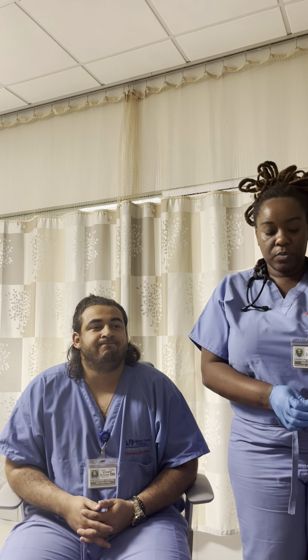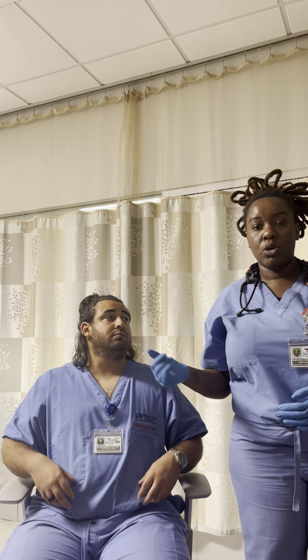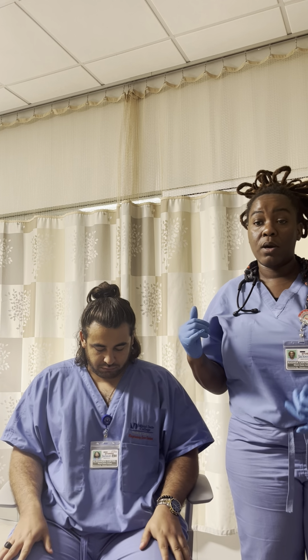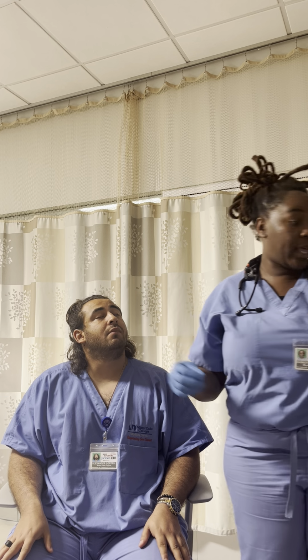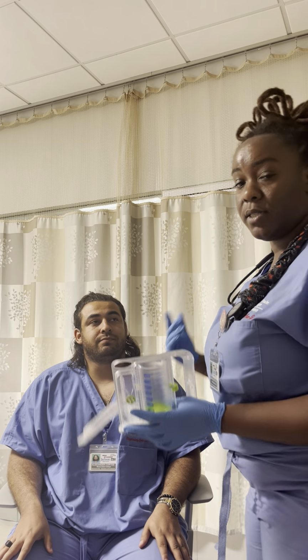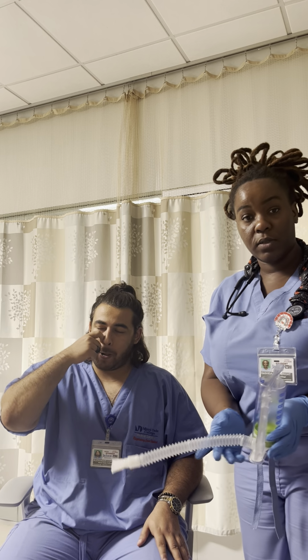So now I'm going to verify that this patient is able to perform these procedures. Make sure that he's able and has a non-altered mental status. Okay. So my patient, I confirmed that he's good to go. So now I'm going to instruct him on how to use this device.